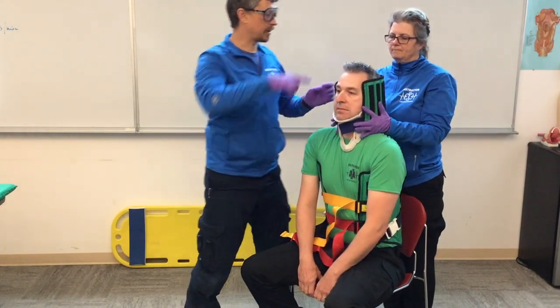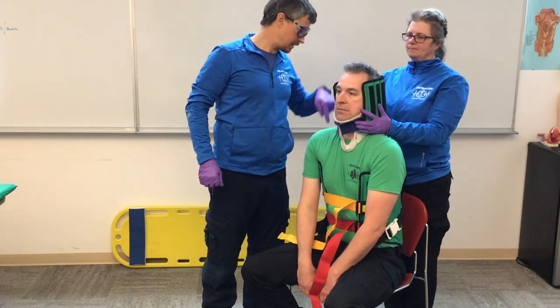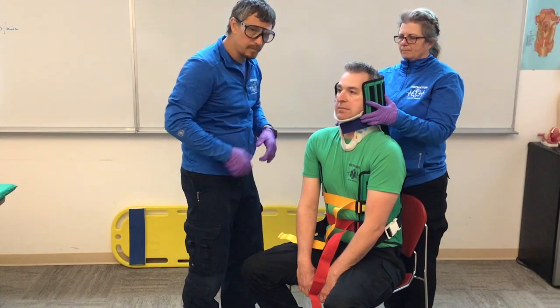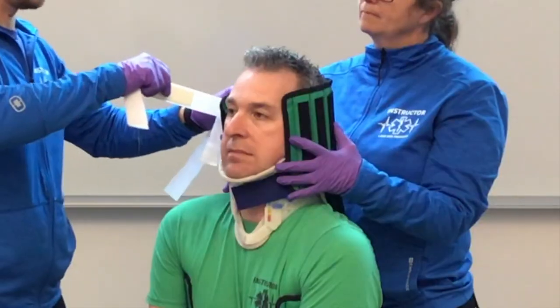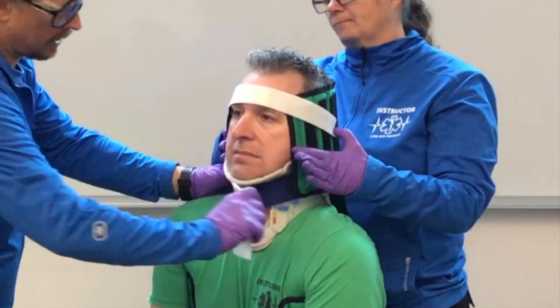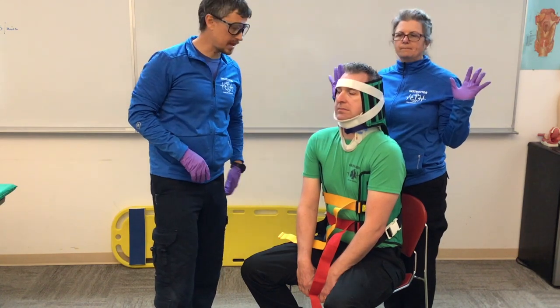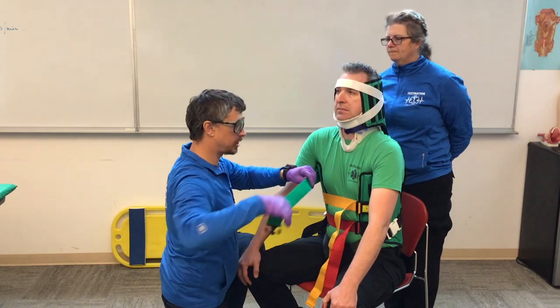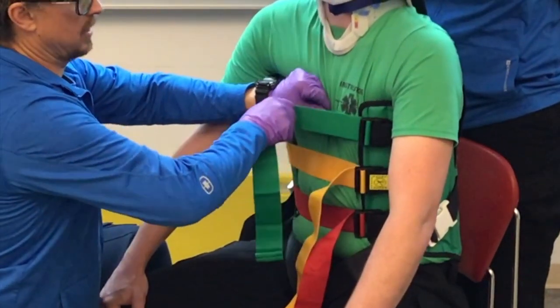Now I come to the head. I evaluate behind the patient's head to see if I need padding. Chandler is sitting up nice and tall with a straight back, so no padding is needed. Bariatric or geriatric patients with more curvature may require additional padding. Cindy holds the head straps tight to Chandler's head to secure it in place, then she can let go once it's stabilized.